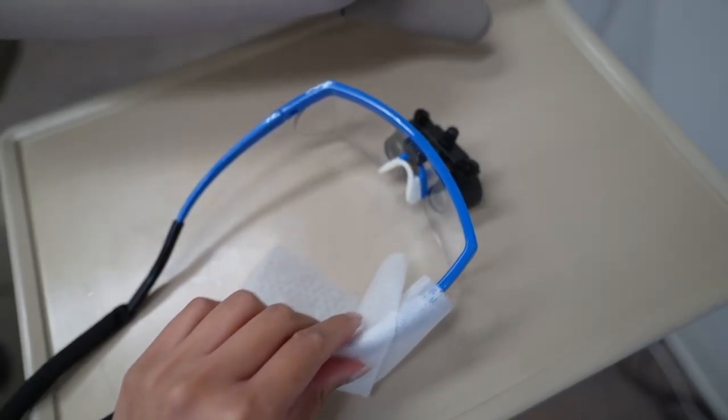To clean your frames, use neutral detergent and pat them dry. Use only a microfiber cloth or lens cloth for the loop, and always store your loops in their case to protect them.